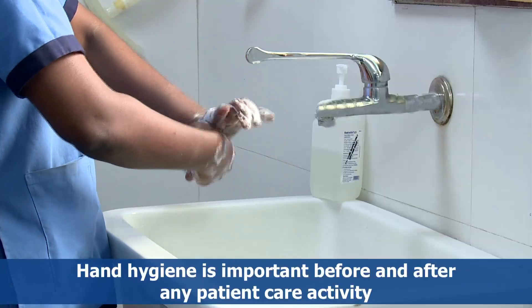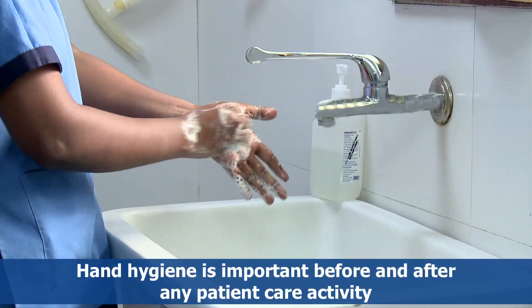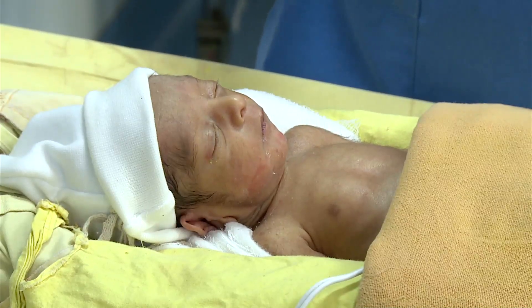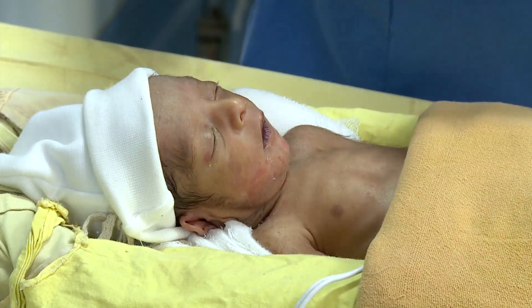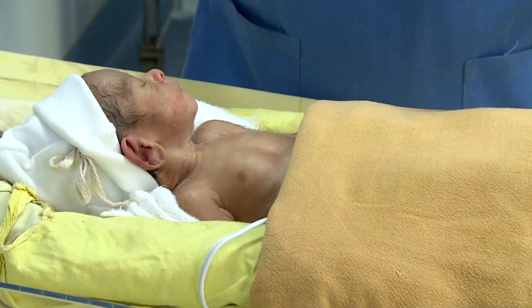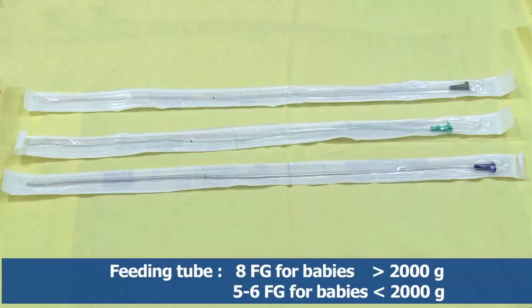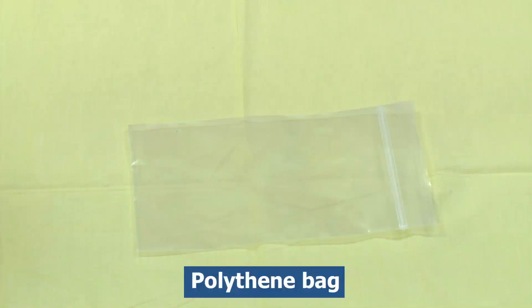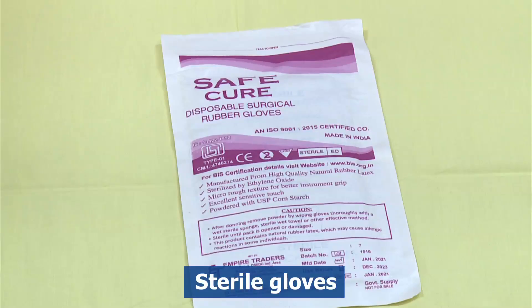In this video we shall see the procedure of gastric decompression. The purpose of gastric decompression is to evacuate air and/or secretions accumulated in the stomach. The equipment required includes a feeding tube — 8 French for babies more than 2000 grams, 5 to 6 French for babies less than 2000 grams — scissors, micropore tape, polythene bag, and sterile gloves.